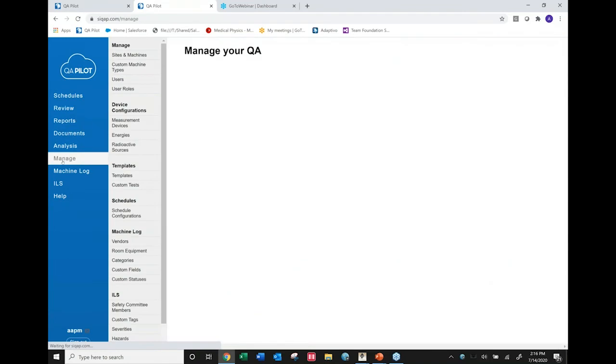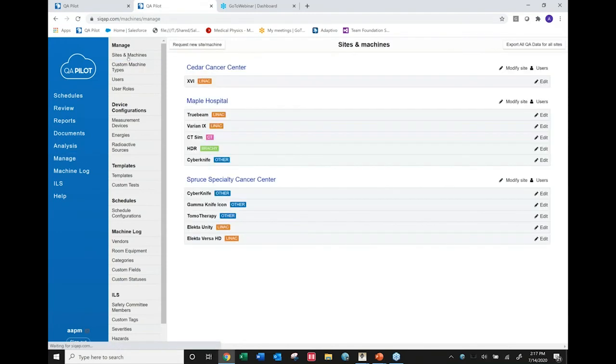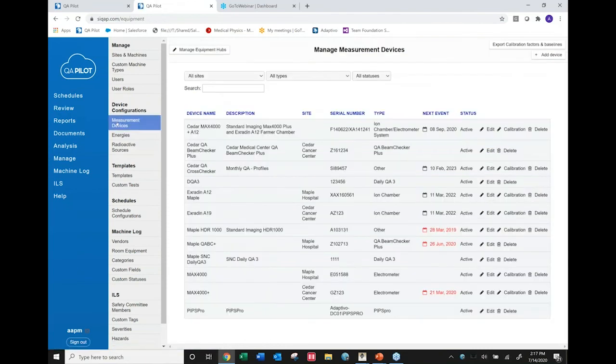Of course, to get to the point where you have schedules that are being performed, you do have a manage section. Again, your sites and machines. You get a summary page of what's going on there. Device measurement devices. Again, this is awesome. It's another quick dashboard review.